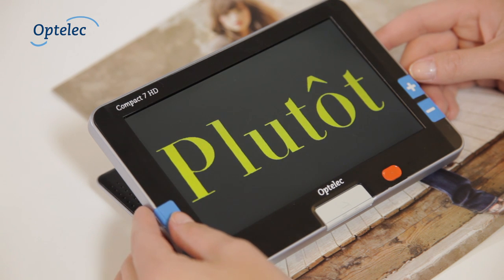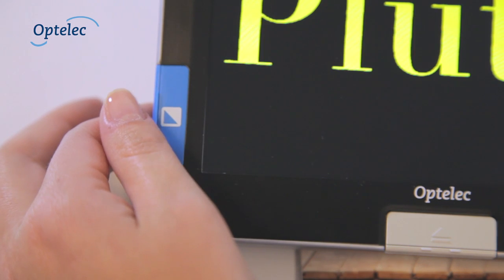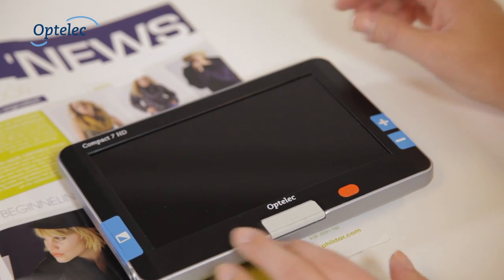Select the desired color settings to read text optimally. Press the Mode button to change the colors. To switch off the unit, simply close the screen.